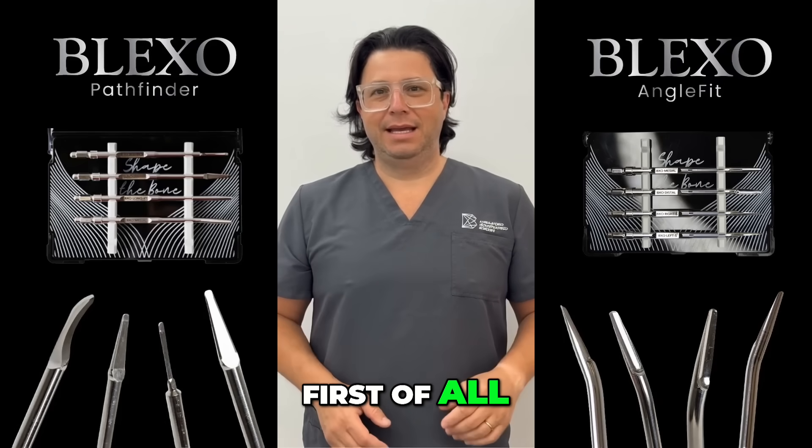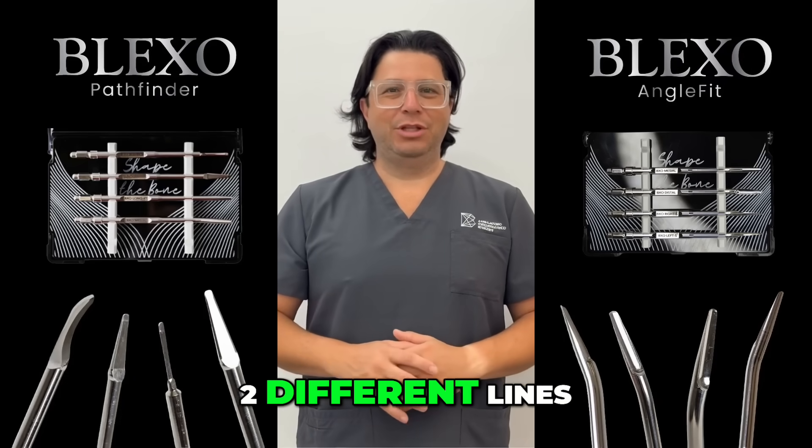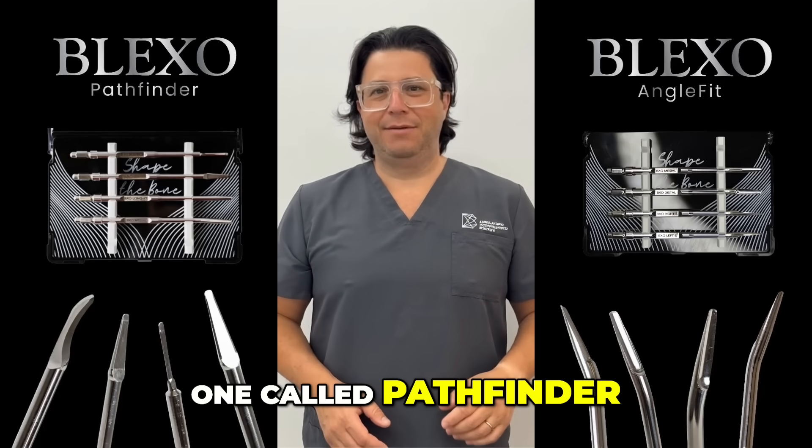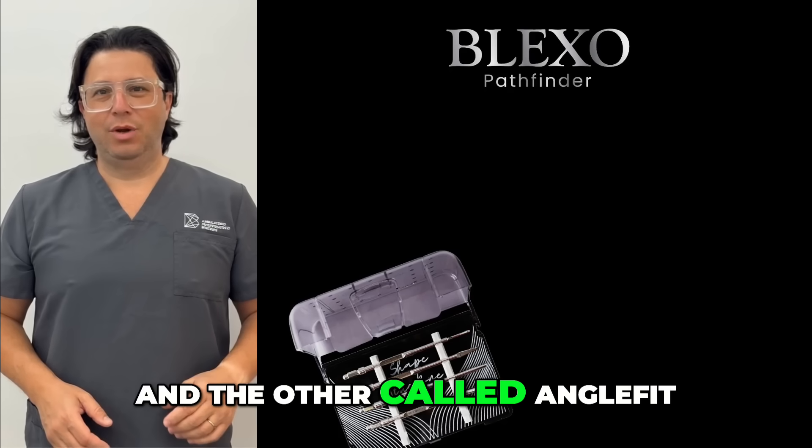First of all, there are two different lines within the BLEXO range: one called Pathfinder and the other called Anglefit.